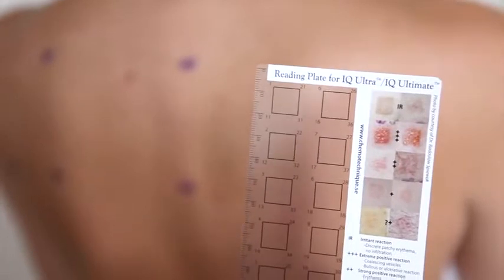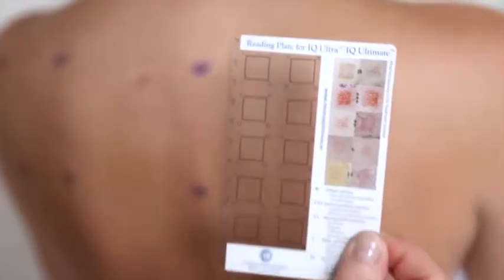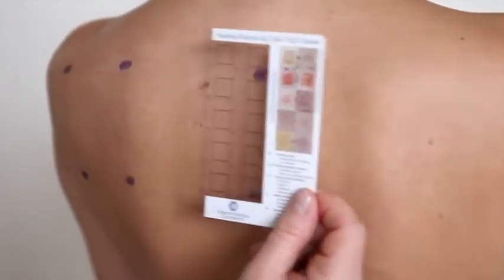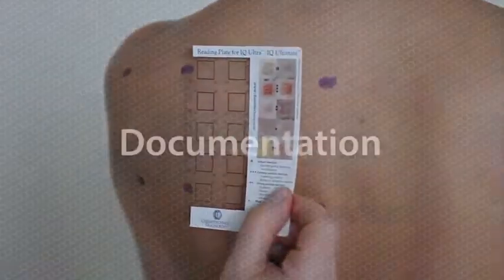Use the reading plate to facilitate reading of the patch test. The test can be interpreted 20 minutes after removal, and thereafter one or two days after removal of the tests.